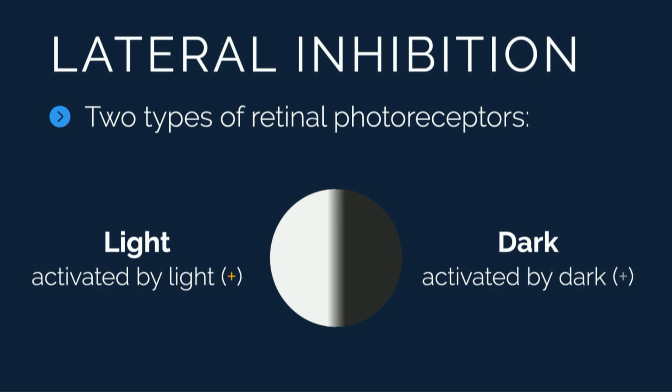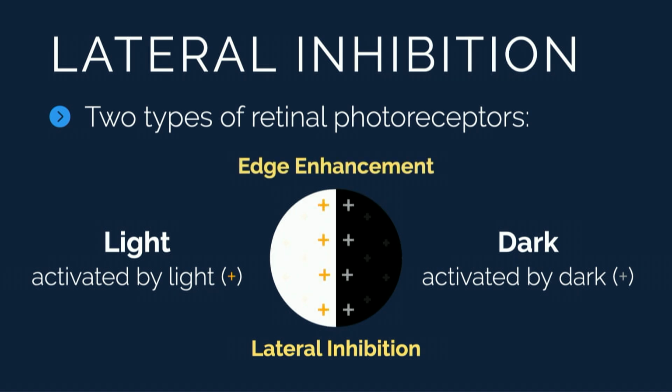And it introduces this concept of what's called lateral inhibition. So they start to compete with each other. And fortunately, there's another thing that happens, which is edge enhancement. So this is all done in our neurosystem and brain. And it takes that interface that is kind of fuzzy, and it forms a more distinct margin. So we get edge enhancement associated with our visual system as we're looking at these images.